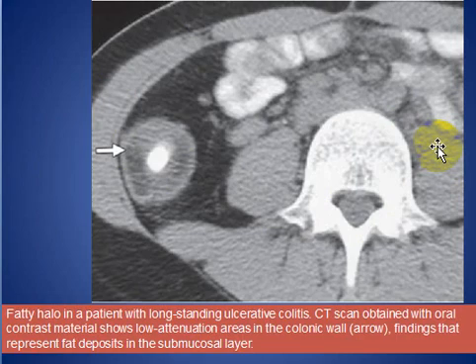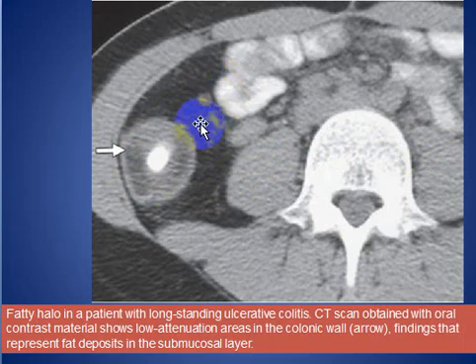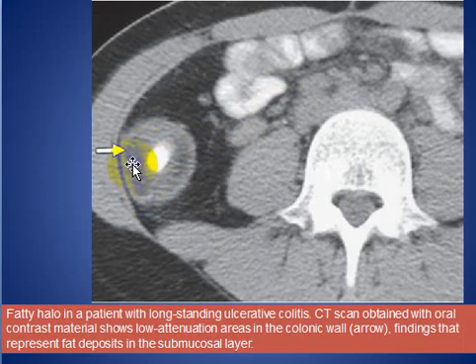Here we see another patient with the fat halo sign in a patient with ulcerative colitis. This is the lumen, and this is the fat deposition in the submucosa. We call this the fat halo sign.